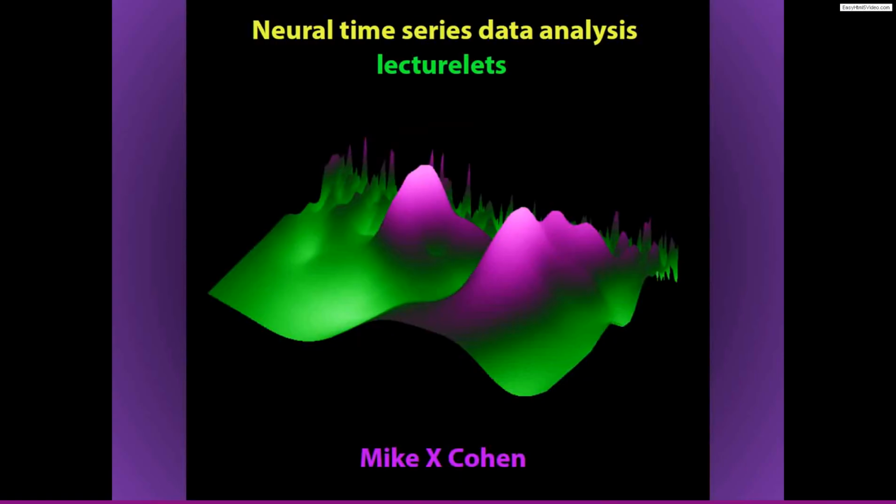Okay, so that was it. I hope you enjoyed it, and I certainly encourage you to experiment with the Laplacian. I think it's a very simple but very powerful spatial filter that has often surprisingly nice effects on the quality of the EEG data.